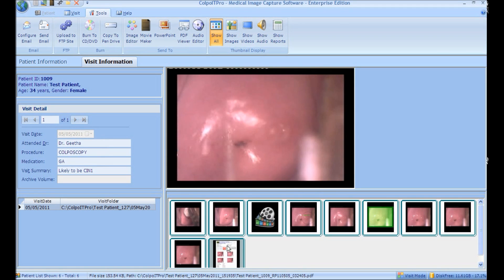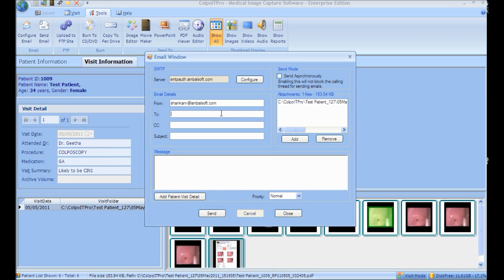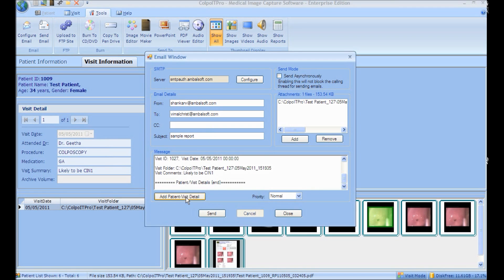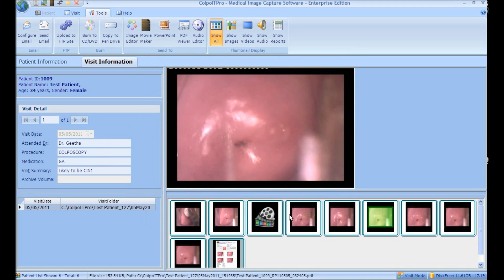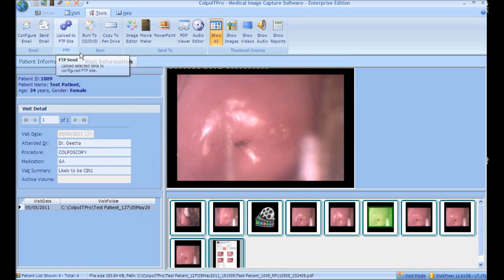For the mailing option, click the Send Email button and enter the email details. On clicking Add Patient Visit Detail, the patient details are entered. The selected data is attached. Click Send and the message is sent successfully. You can also upload data to your FTP site, which is mainly used for telemedicine support.